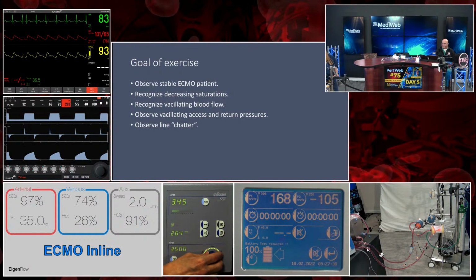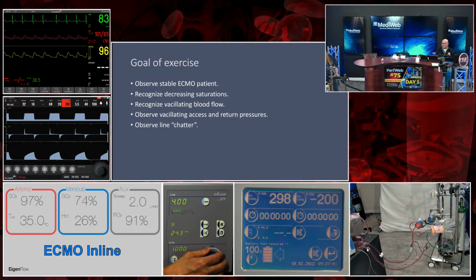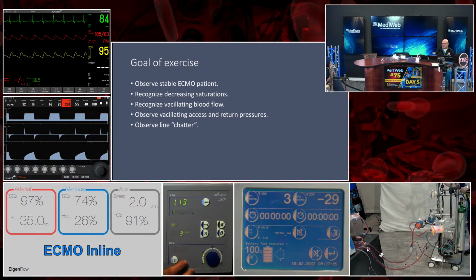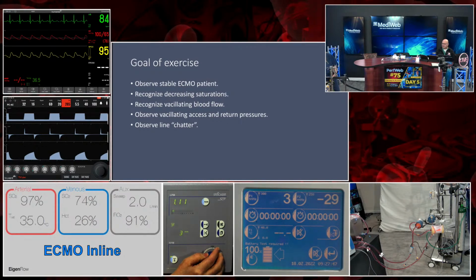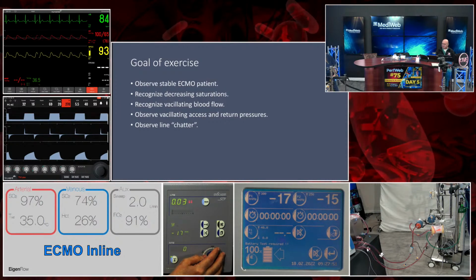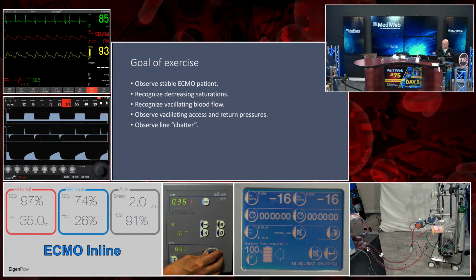With this pump, when you get to 1,000 RPMs, you have to push the down arrow, sorry, it's backwards for me, so I have to think about that a second. Yep, and we've got to push down the safety. There you go. Turn it back on. That's good. Okay, and go back up to 4 liters or so.